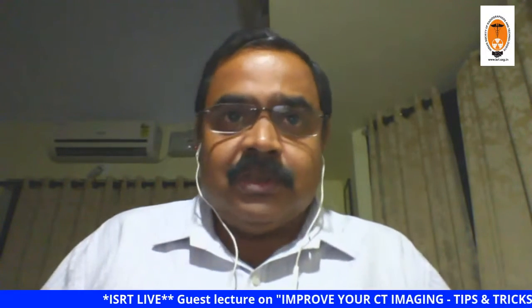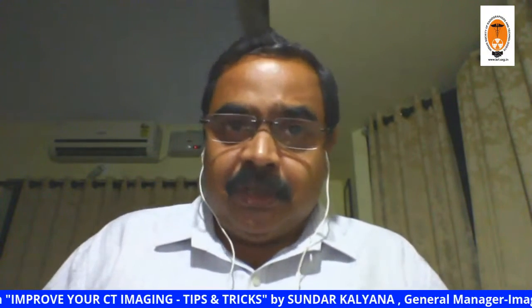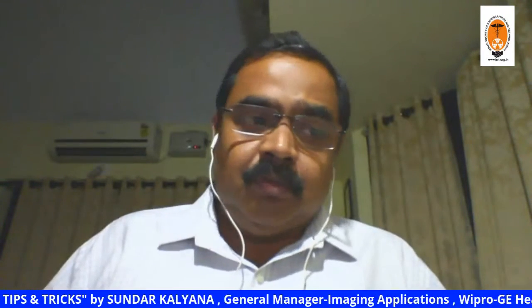Sometimes the age goes to 7 to 8 or even 10 or 12 years, where the bone is already thicker. So use of 80 kVp for that population may not give you sufficient penetration, or it may result in beam hardening, especially when you are imaging the soft tissues in the IAC temporal bone area.